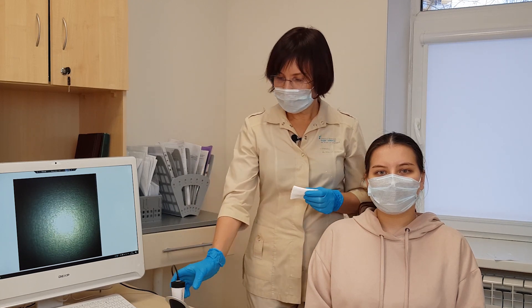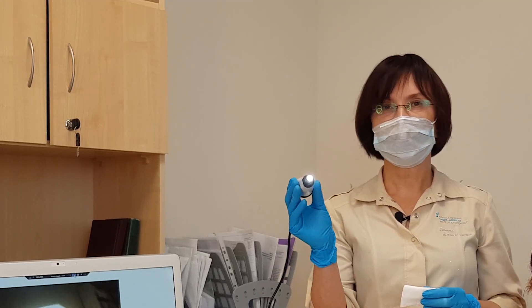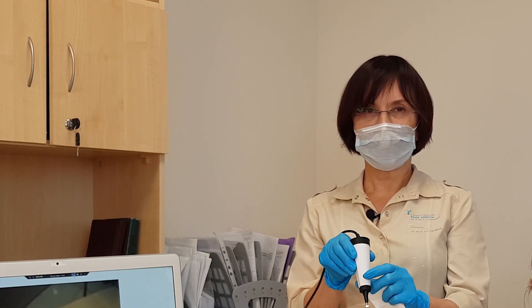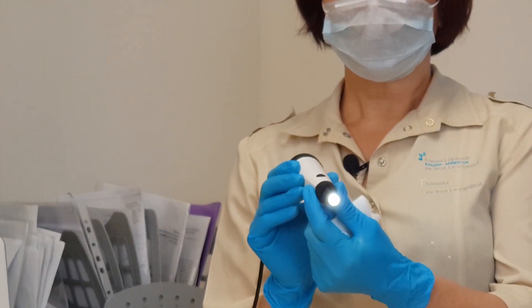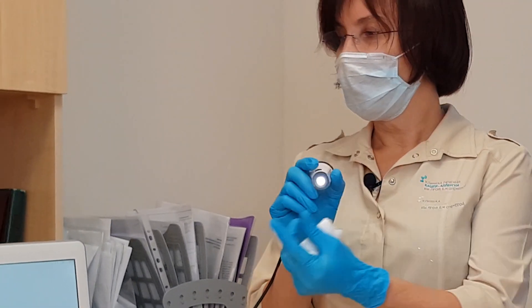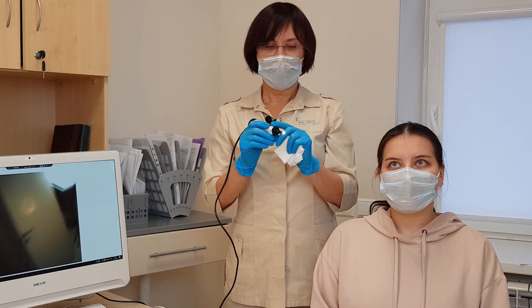I want to show you how to use a digital endoscope. You can see that it's small, and you can see the black button here. When you want to make a photo, you can push the button and the photo will be saved.